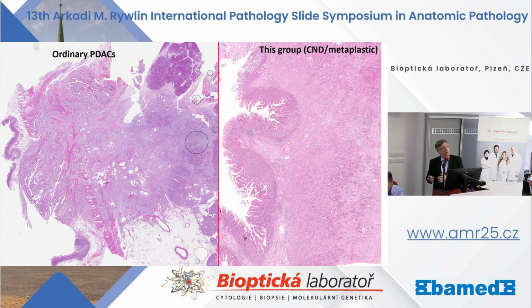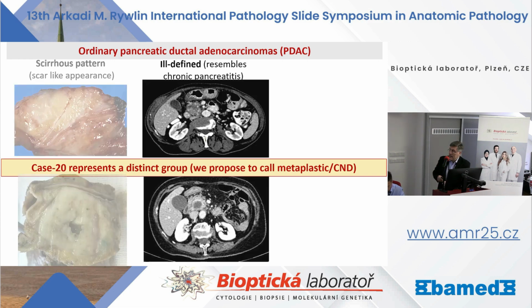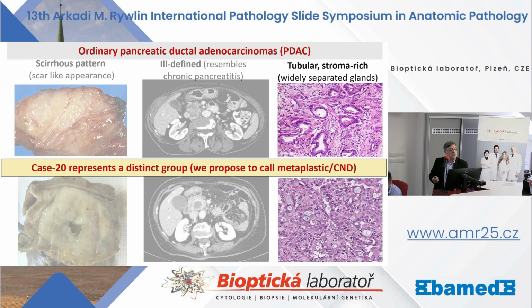Whereas the group that I'll show to you is distinct in the sense that they stop, they are demarcated for some reason because they have a more compact nodular growth pattern, especially at their advancing edge. So they do have this more demarcated central necrotic growth, leading to these more round tumors in the pancreas itself. And that is due to the more sheet-like configuration of the cells that we see in the lower right picture.